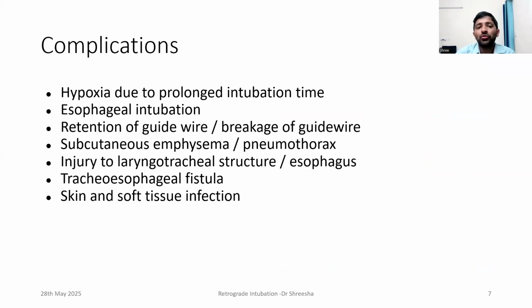So what could be the complications? Complications is mainly hypoxia due to prolonged intubation time. This usually occurs if you do not choose the right patient for this procedure. In a simulated scenario, it was shown that this procedure in experienced hands takes around 70 to 75 seconds on average.